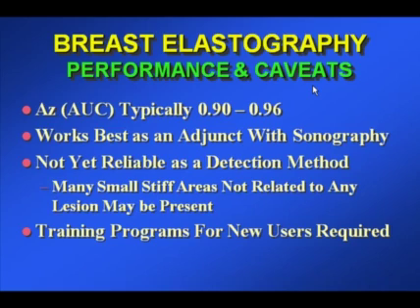One thing that has been found is that considerable training can be required for new users. Although a user may be able to create an elastogram fairly quickly, learning how to interpret the various nuances, which images are best for interpretation, and the various appearances of lesions on elastography can require some amount of time, and a consistent training program has not really been developed. But I expect over the next few years such training programs will appear and performance will improve.